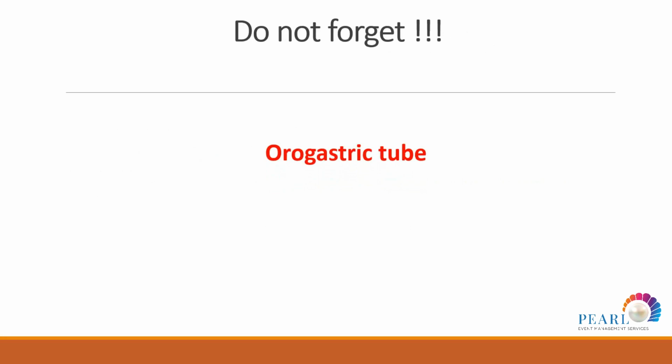Please don't forget that intubation and laryngeal mask have a very simple complication that can sometimes be confusing. A lot of air will go through the esophagus to the stomach. Therefore, you must use a feeding tube or other names, a gastric tube, especially to take away this air. Please don't forget about it.